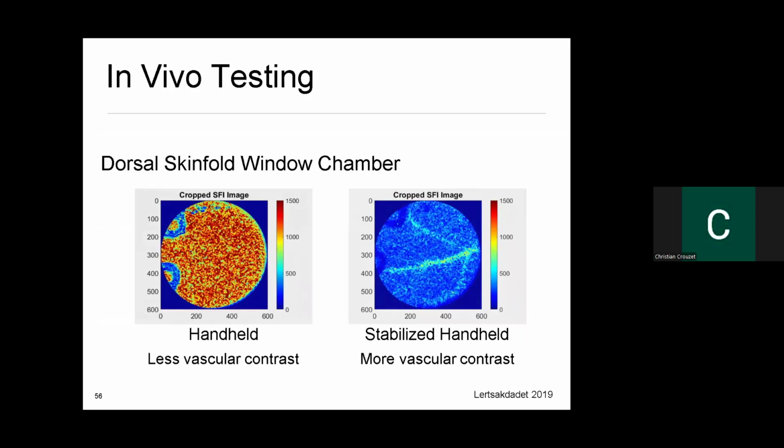The question was what was kind of the working distance. I don't remember what it is off the top of my head for this system. But within the LSI system, there is a variable working distance depending on what you're using it for. You can be a couple of feet away or be like almost a microscopic view distance away.